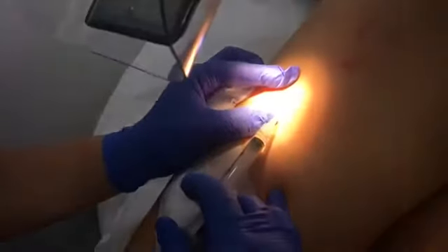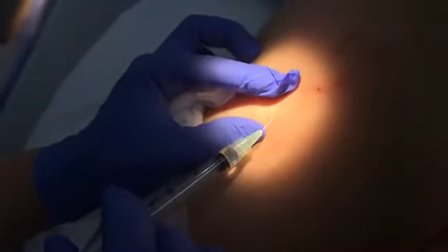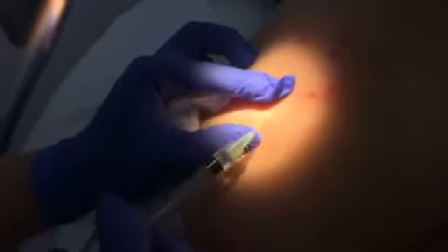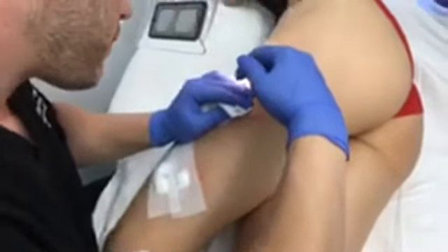And the key is using this polarized headlamp. It's the only way you can fully see very fine veins. Okay, now it's right here. Let's go to this bigger guy here. See those bigger ones, look at it spread all through here now. That big one that we injected just fed all of those other ones, which is great.